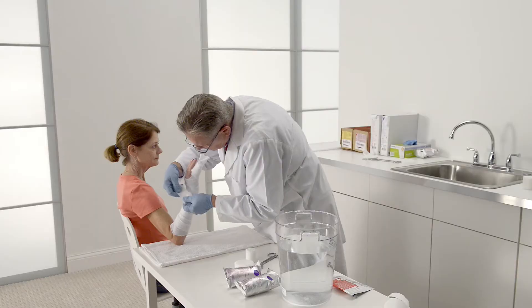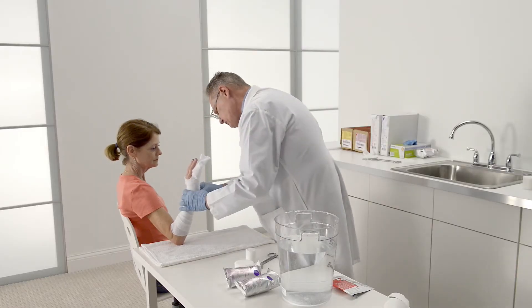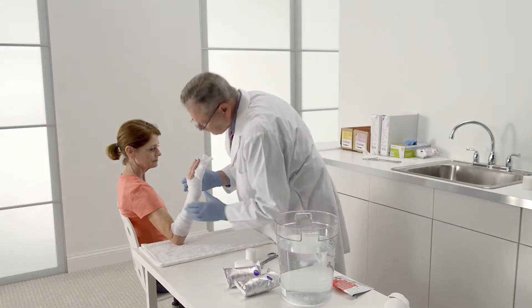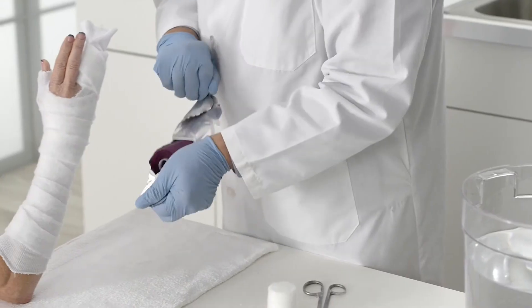Inspect the padding to ensure the extremity is adequately protected. If necessary, add additional padding to bony parts of the hand or arm.